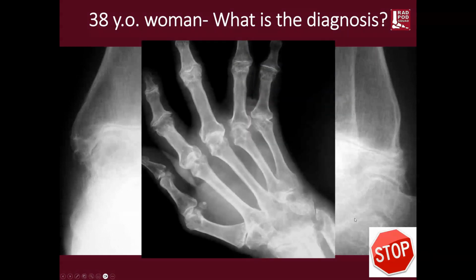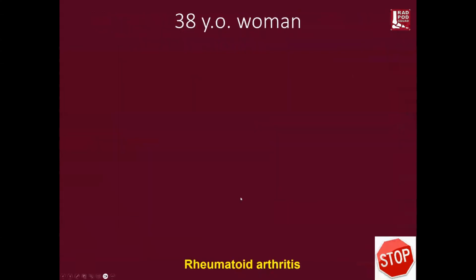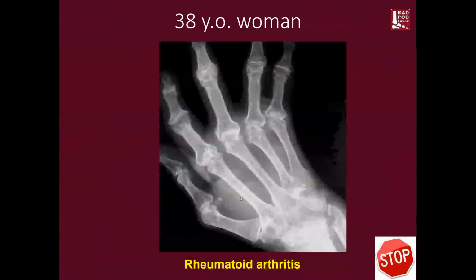The person's hand. We can see in this case we have concentric diffuse joint space narrowing characterized by erosions and some minimal bone formation in this patient who is suffering from rheumatoid arthritis. This is a late stage case of rheumatoid arthritis where you're seeing joint space narrowing, osseous fusion at the wrist, MCP and PIP joint space narrowing, and very little bone production to heal.